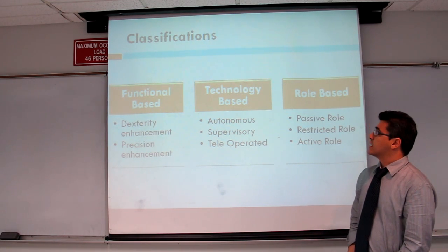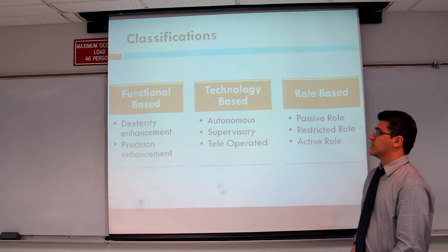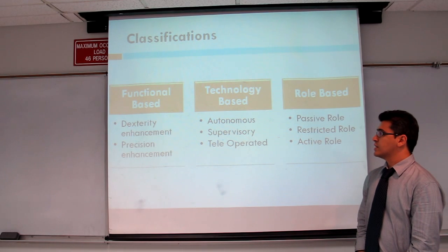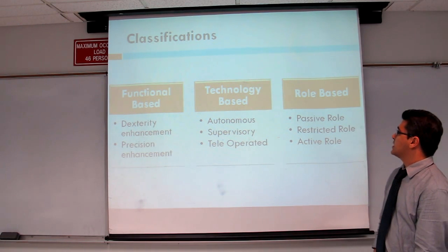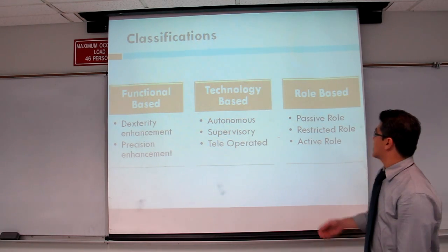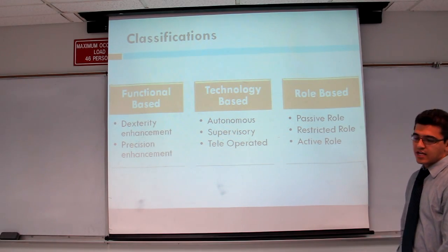For the technology-based classification, we can classify them into autonomous, supervisory, and teleoperated robots. And for the role-based classification, we can classify them into the passive role, restricted role, and the active role.